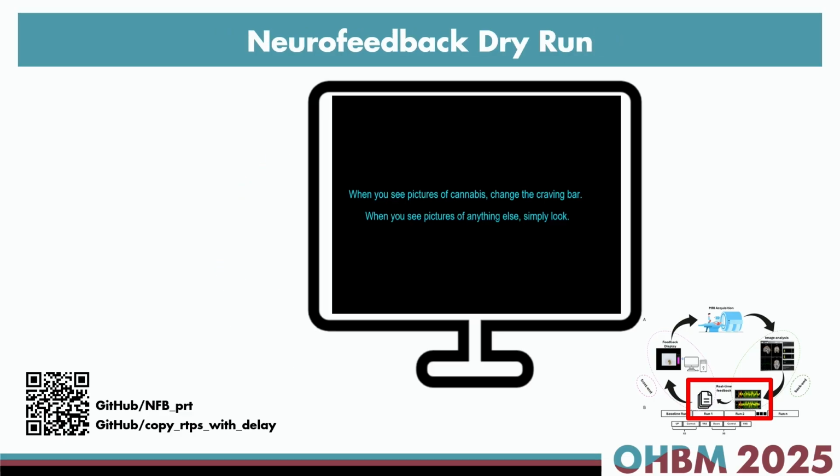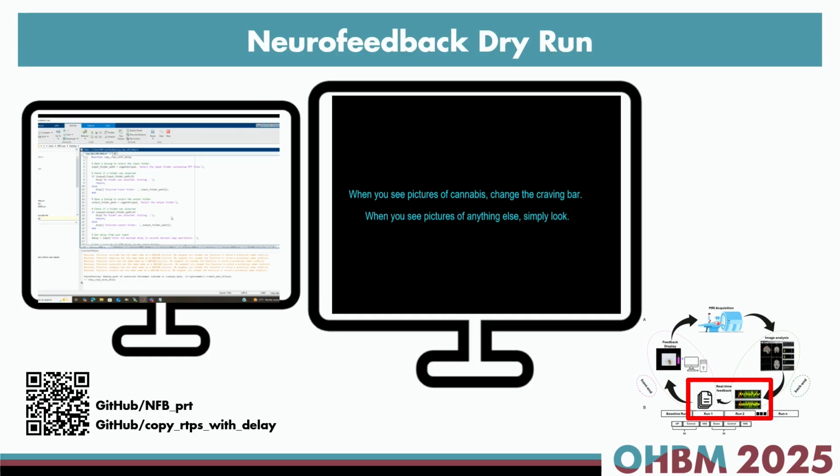if you scan this QR code, you can have another script. So probably you have a bunch of RTPs somewhere else in another folder. Using this script, you can ask your script to drop your RTPs into a new folder. And instead of having all that set up in the background, you can just drop RTPs every 1 second into a new folder, which you can use as a watch folder for your script.